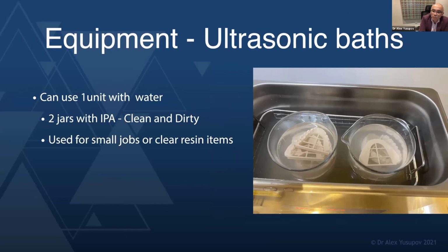You can use water in your ultrasonic and then have IPA in little jars or beakers. Some people use peanut butter containers. I find at some point there'll always be a bit of water getting into the IPA and IPA getting into the water, so I've stayed away from that. What I do now is, if I have a small part like a restorative material, it's got to be a certain color, then I will put it on its own into a beaker of IPA, so it's not contaminated by other colors of other resins.